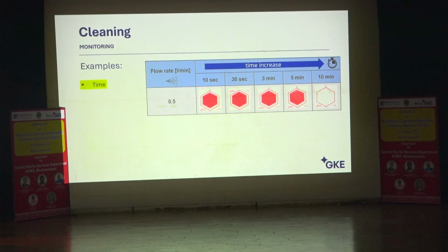So you have a deviation that would have passed unnoticed, and the indicator has said something is wrong. And together we found out, well, it was the short program. So it's nothing broken, it's no catastrophe, but we have to make sure that these products are not released. And this is what the indicator is good for concerning time.